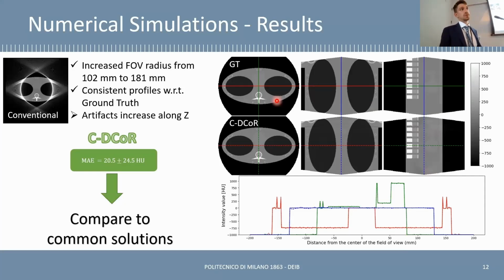This is just drawn because it's a numerical phantom, so you don't have any artifacts. But here you do have some artifacts, and I guess here as well you might see some artifacts around the spine of this thorax phantom. They're probably being suppressed by the grayscale. Yeah, but they are still there.